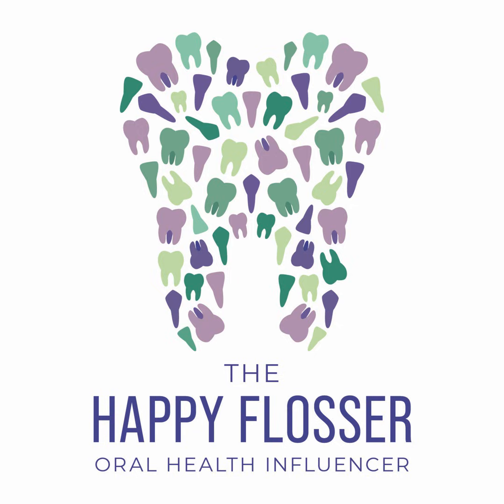So I might have to cross-reference the bite wing radiograph with the periapical to see if something looks a little bit different when I see a radiolucent notch or something in the enamel. And we know that's why it's so important that we don't have overlap on those bite wings. We need to have an open contact. So that's why I said it starts with those quality images so that you can properly look at all of the things and assess them correctly.